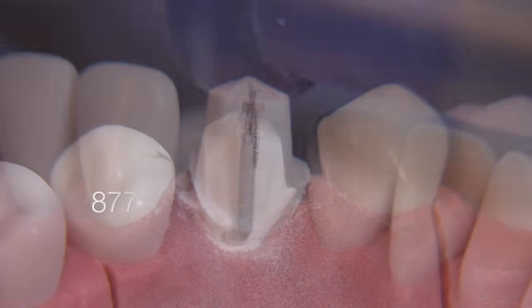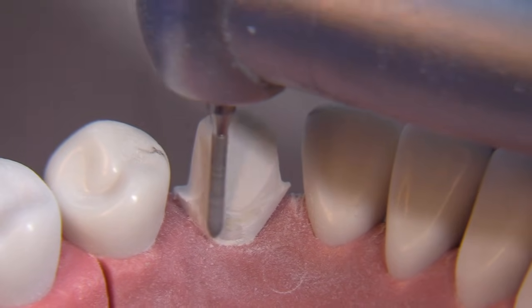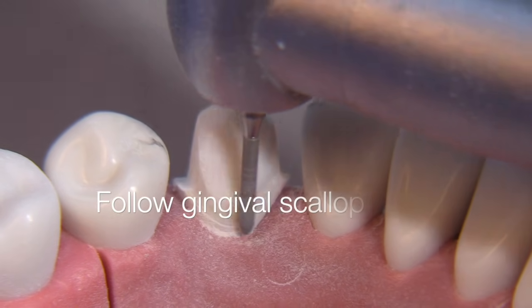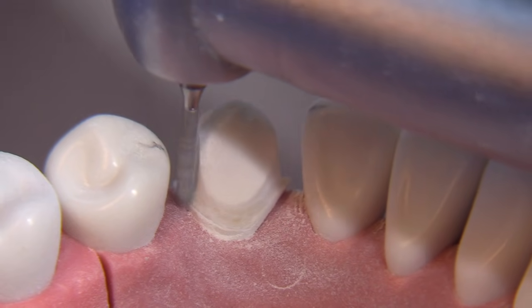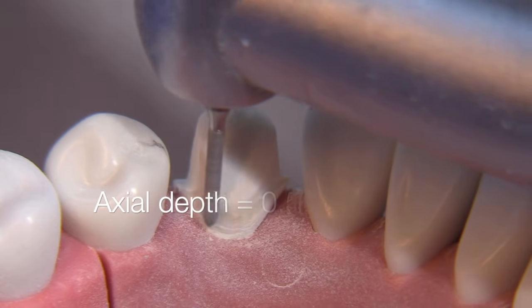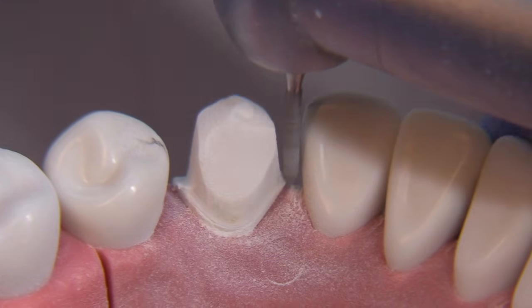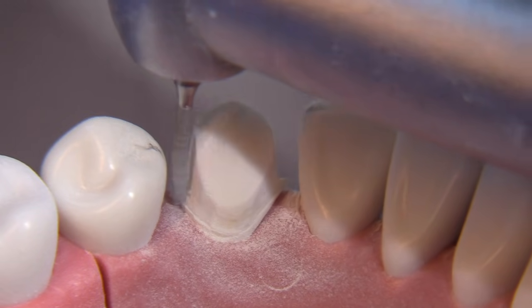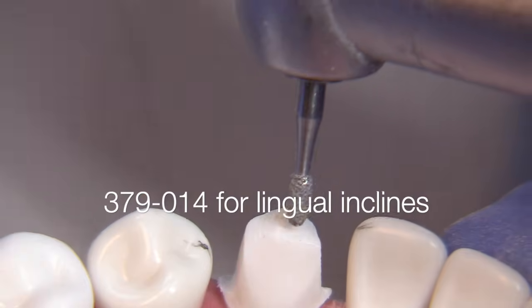For the lingual we're going to use the 877-009 bur, which will create a true chamfer — not something more like a shoulder, which is oftentimes what's being done these days. This is a declination angle of about 60 degrees with a depth of 0.5 to 0.7 millimeters. Once finished with the chamfer, let's move on to the lingual inclines.